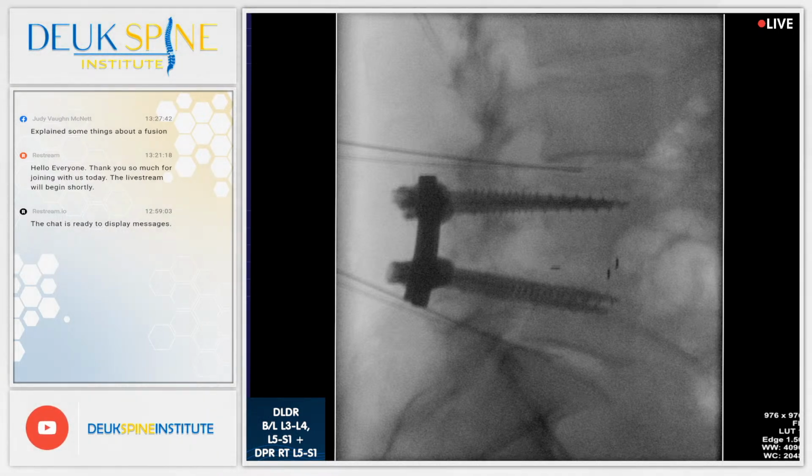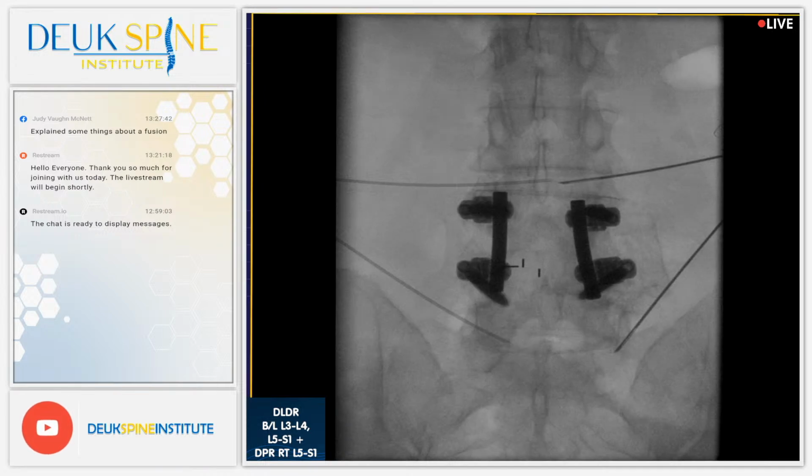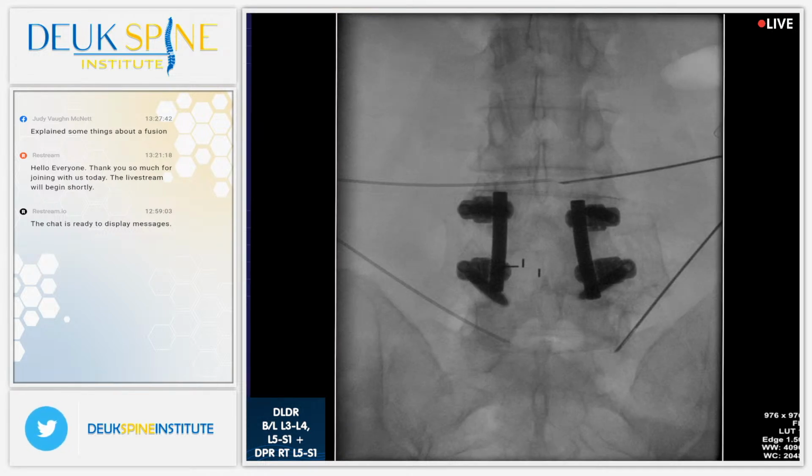I'm going to ask you a few questions, then we're going to put you to sleep and finish your surgery. Yeah, I think that's glancing. So take a look at the needle on the left at L5-S1, folks. We're talking about the disc below the fusion. That needle, follow it, it goes past the facet, and then it keeps going and goes into the disc, through the tear. The one on the right kind of hits the facet and it's getting pushed not into the disc but lateral to the disc. So I have a bad feeling we are not in the disc on that one, unfortunately.